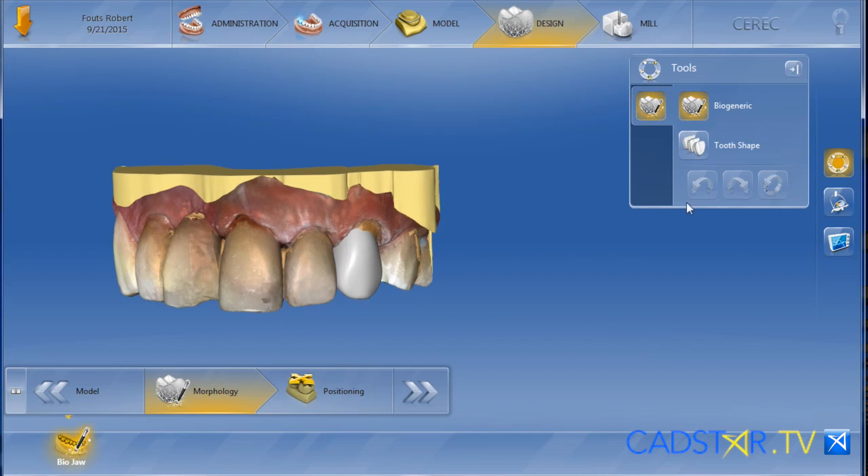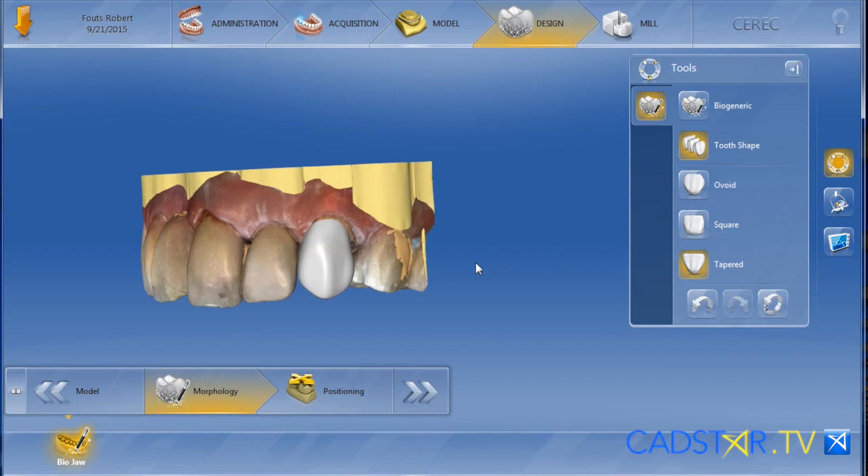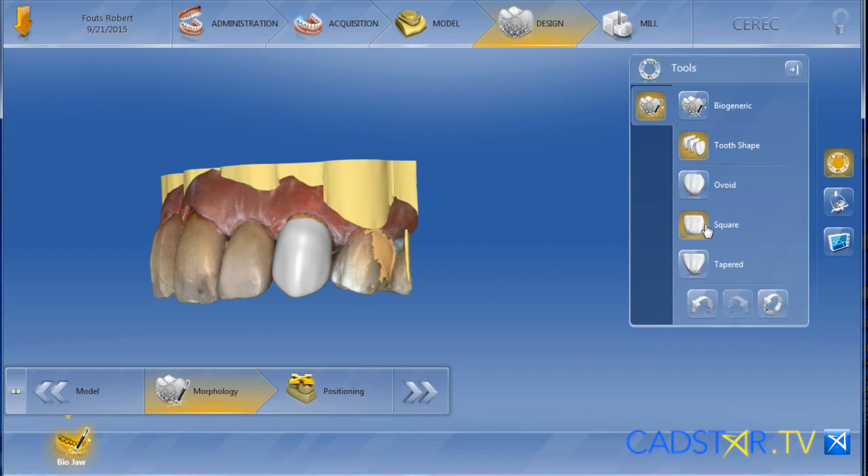For instance, look at this canine. When you see the BioGeneric proposal arrive on the screen, if you switch right over to BioJaw, you can actually use the templates to toggle a different shape in a very quick action.